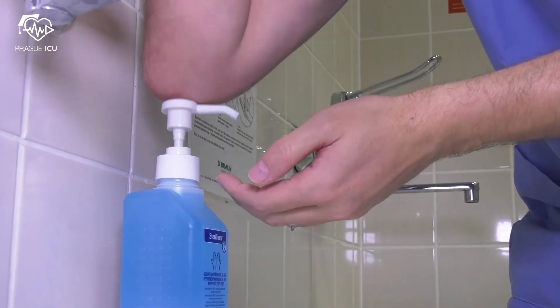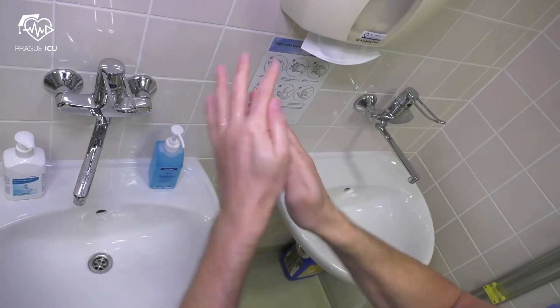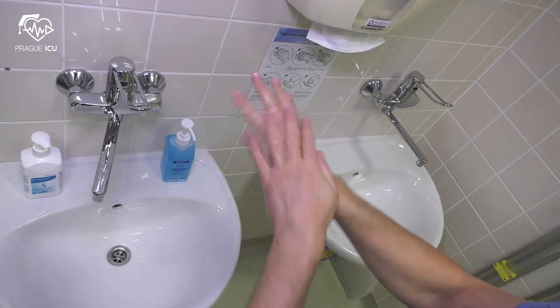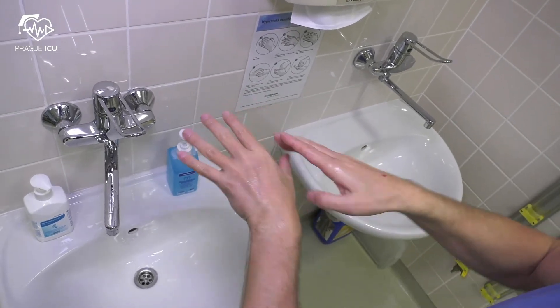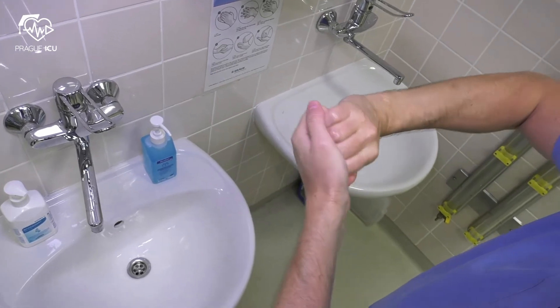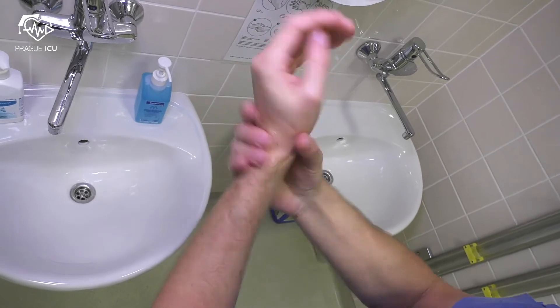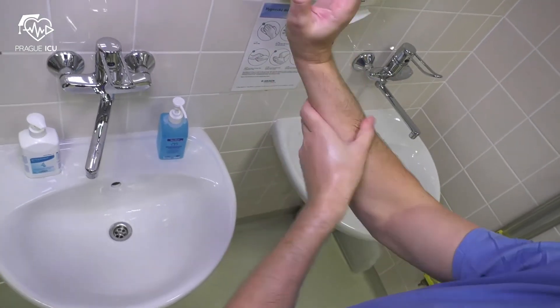Then proceed with hygienic hand disinfection with alcohol disinfectant in an amount of approximately 3 milliliters for at least 20 seconds, rubbed into the dry skin of the hands until they are completely dry. Hands are not rinsed or wiped.